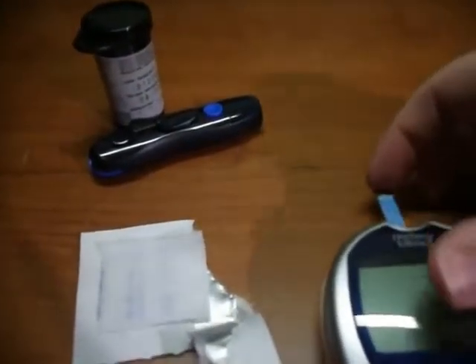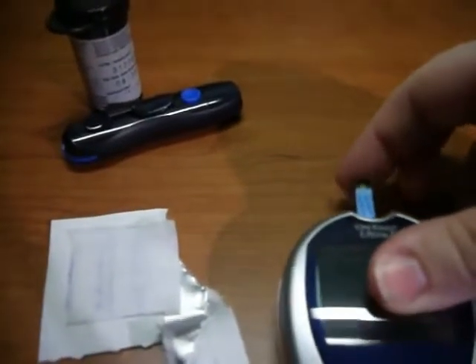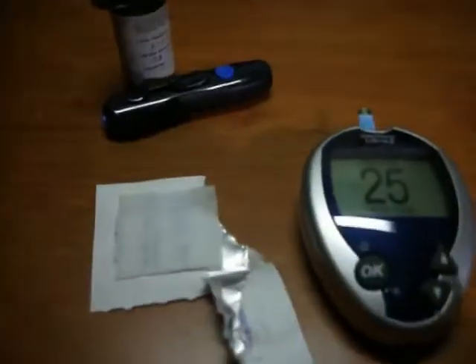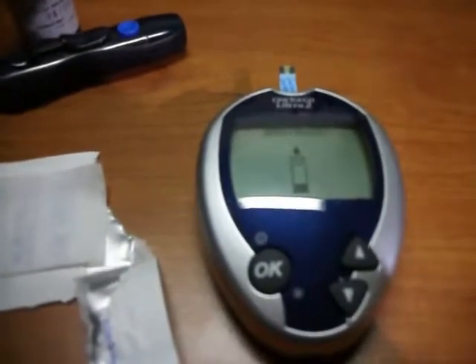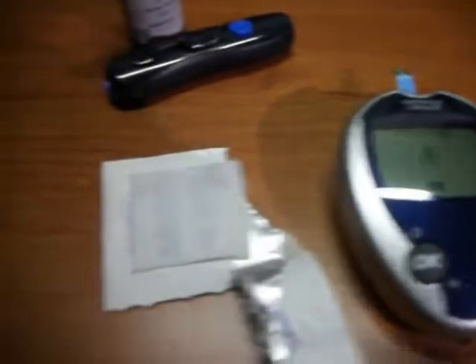First thing that I am going to do is insert the test strip into my meter. It's calibrating the code right now and now it's ready for the sample.